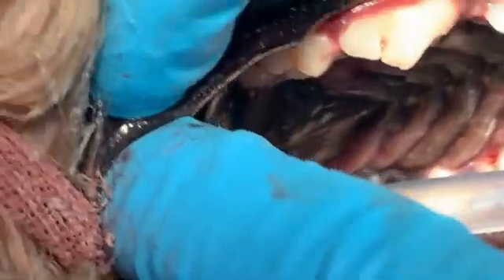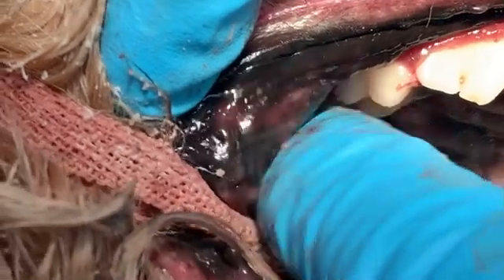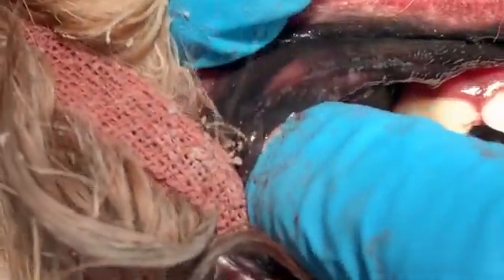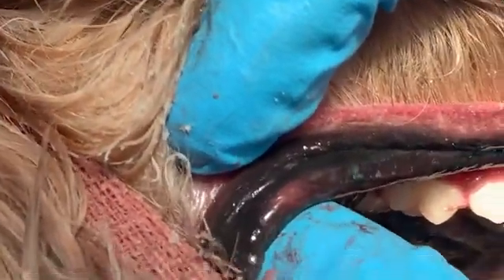This dog has a diseased second molar, the furthest back right here. It's kind of hard to get to, but there is a good trick to getting it out.